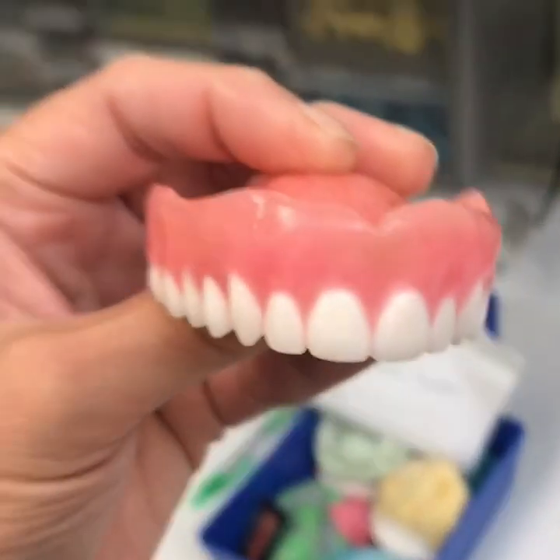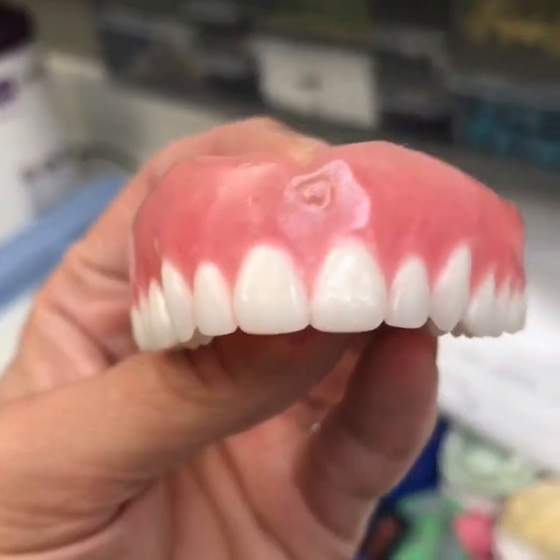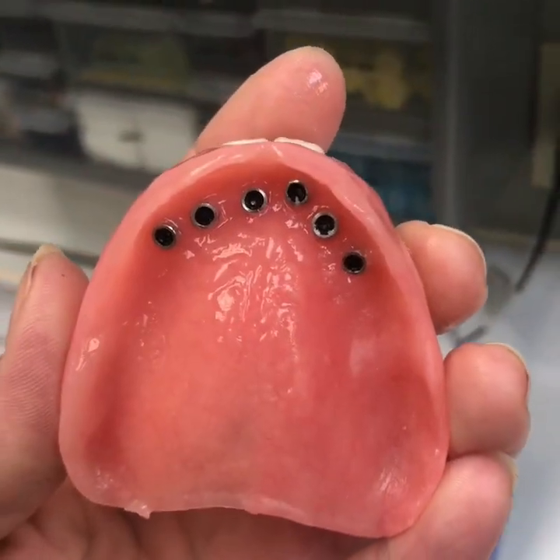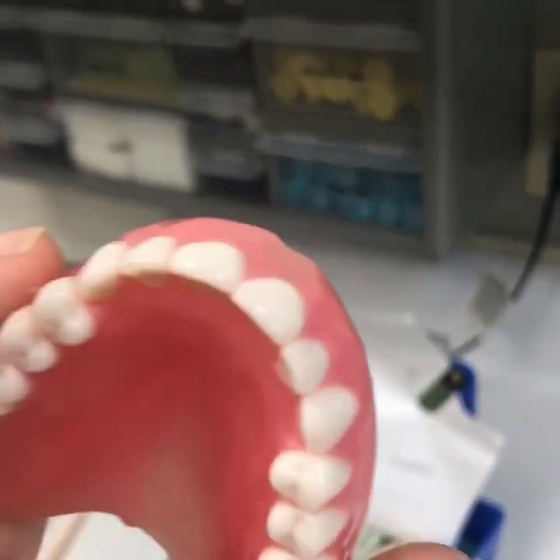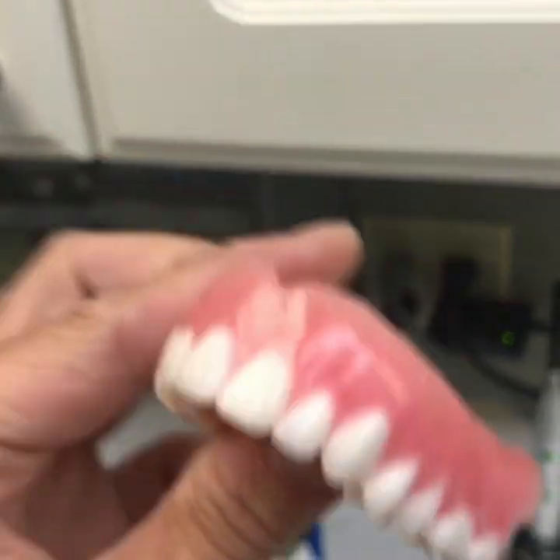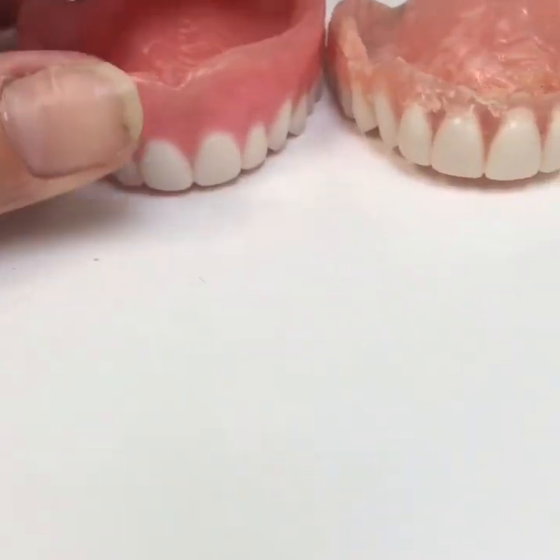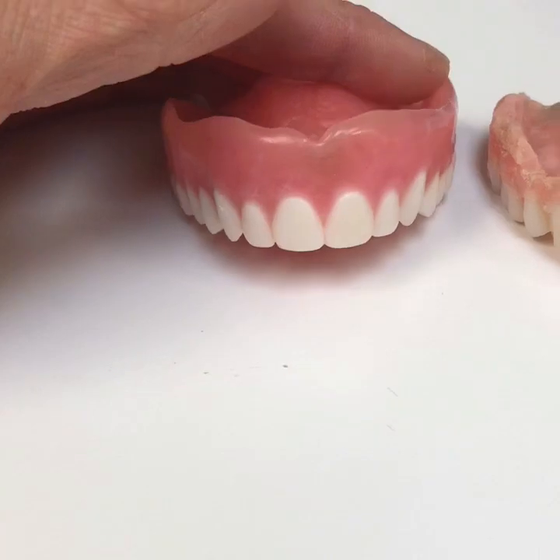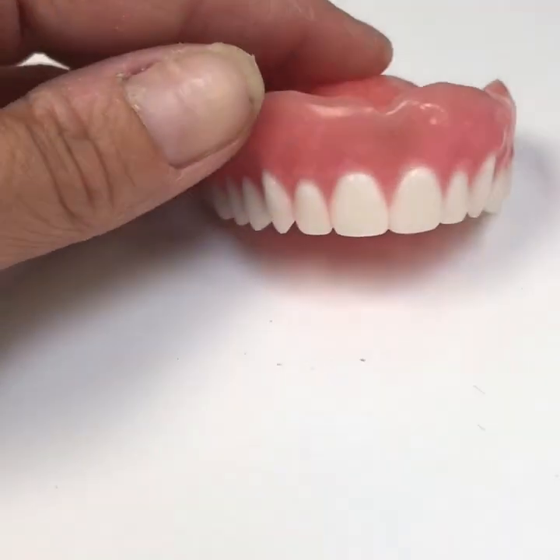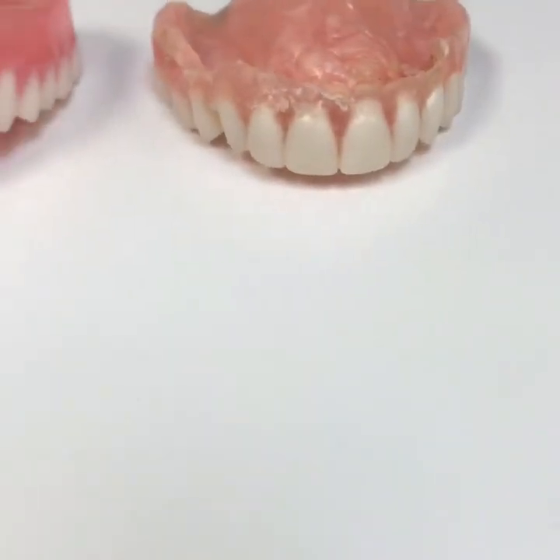Alright guys, here's the final wax try-in. Here's what it will look like without the palate. So, what do you guys think? Alright, here's the comparison. Here's the permanent wax try-in and final. Here's the temporary. New soft reline. I'll be back to finish.